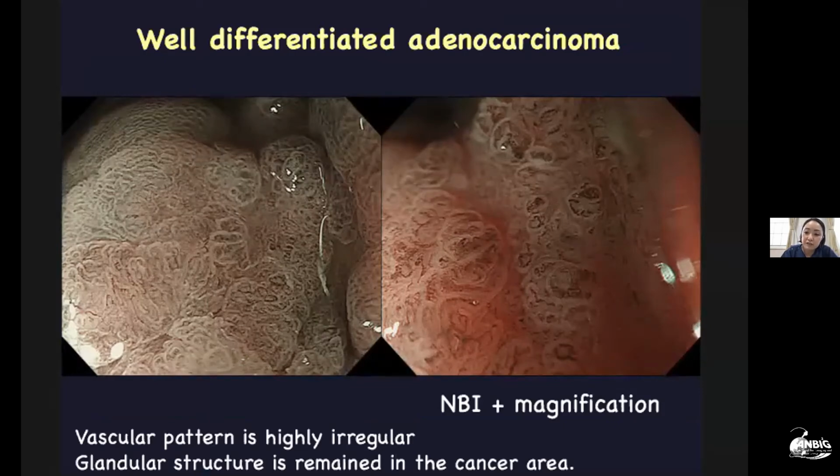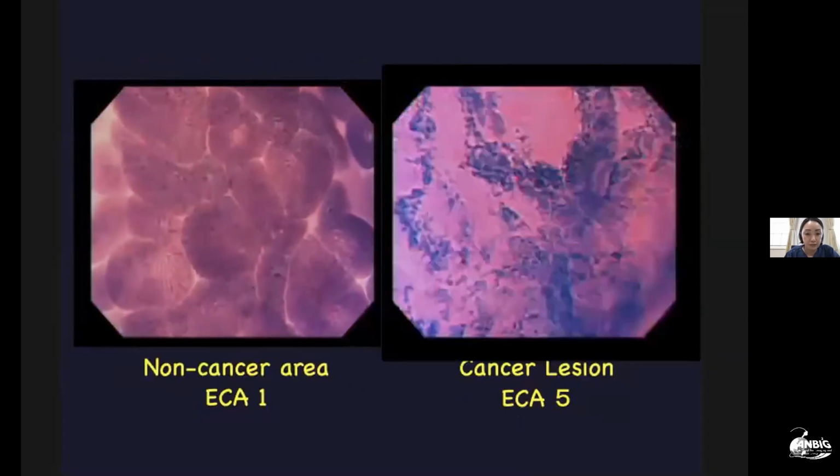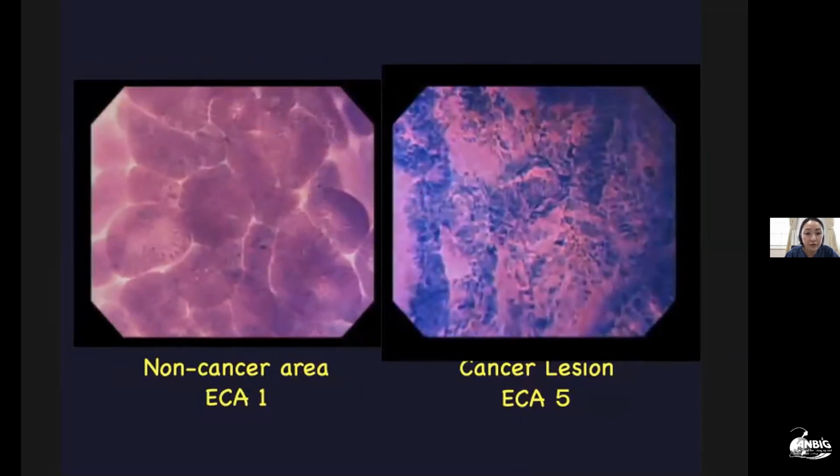Therefore, we can predict the lesion as a well-differentiated adenocarcinoma. With endocytoscopy, compared to background mucosa, enlarged nuclei and increased cell number are clearly recognized in the cancer lesion, but the glandular structure still remains. So we can predict the lesion as a well-differentiated adenocarcinoma.